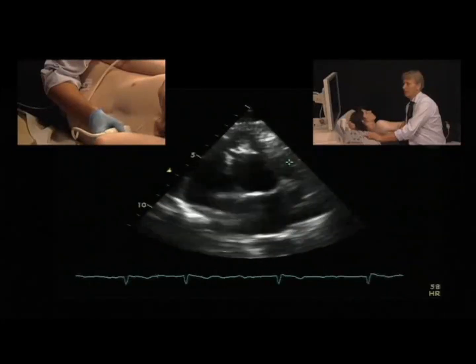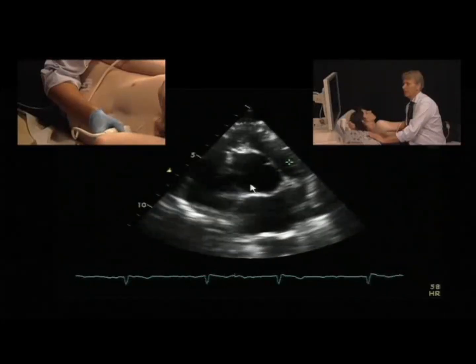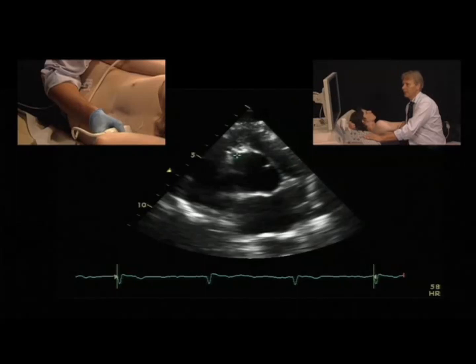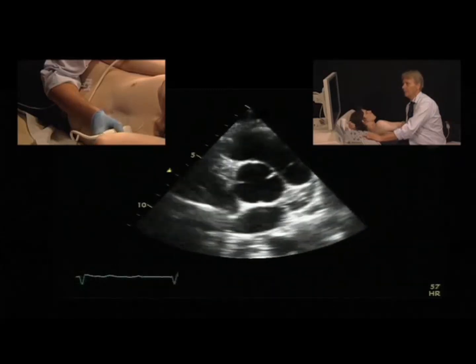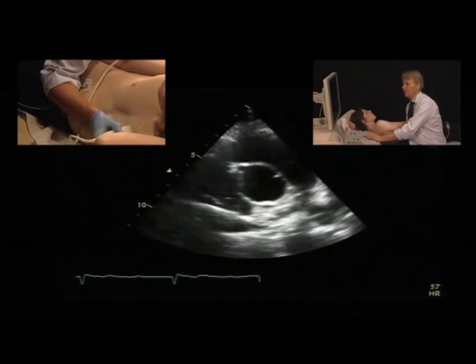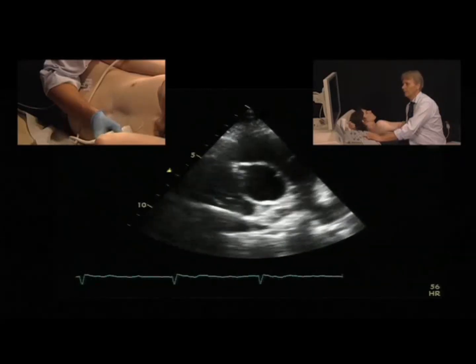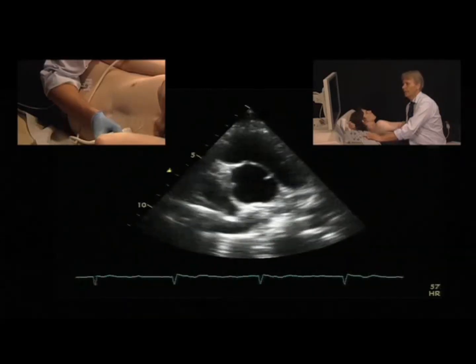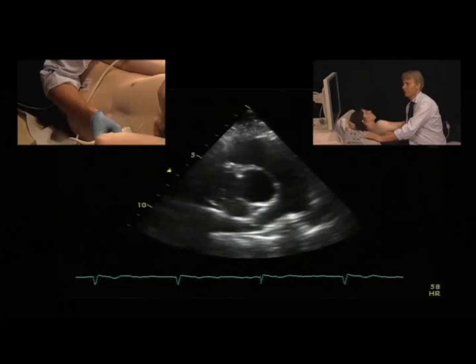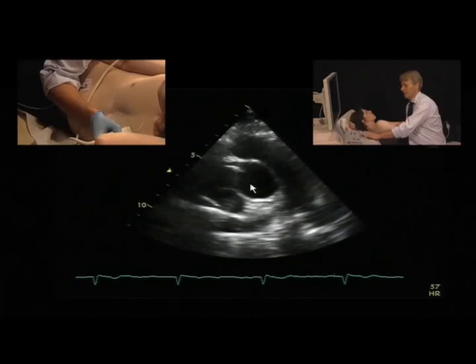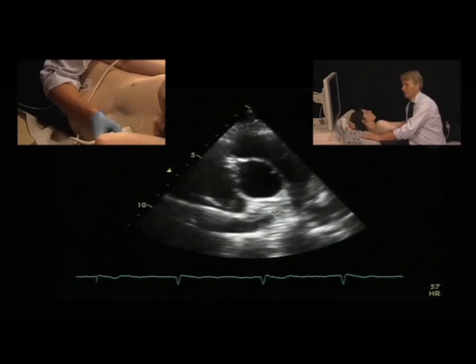We can also see certain details at this level — for example, it is possible to even see the origin of the right coronary artery. The left coronary artery is more difficult to visualize in the short axis view.